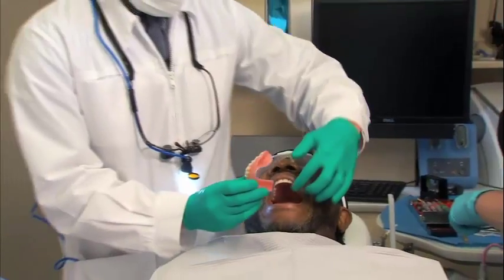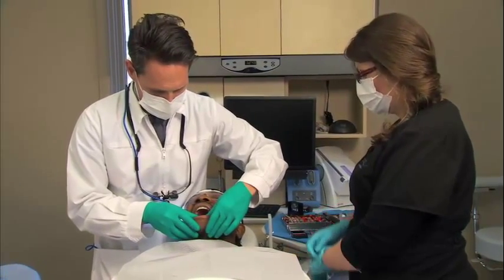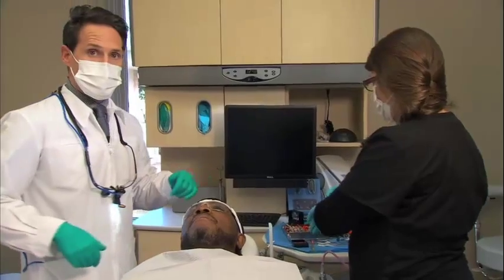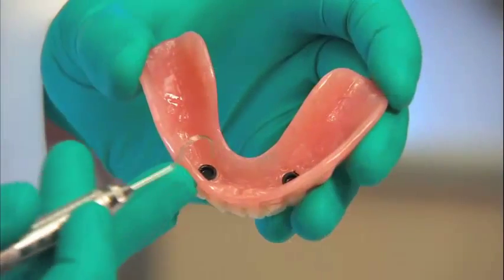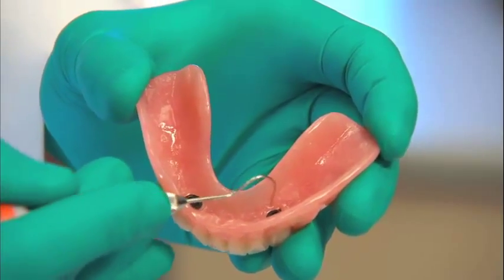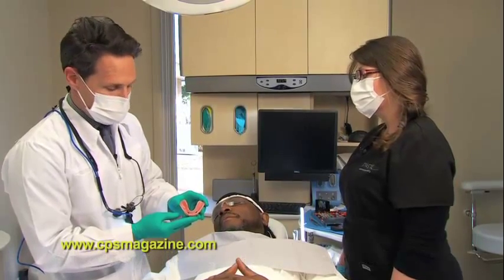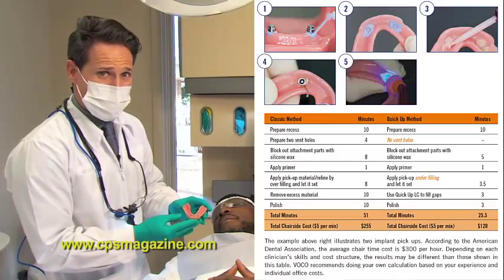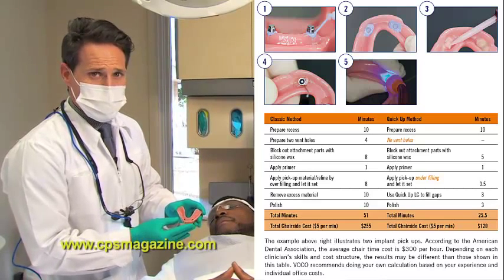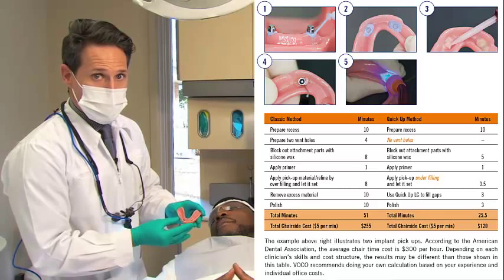I'm going to have Byron open, then seat the denture and have him close with light pressure at about fifty percent. Roberta is going to start the timer for two and a half minutes and we're going to let that sit. This looks great — using the QuickUp self-curing composite material we have very few voids. We still need to replace these black nylon housings with the locator housings. I completed this whole process in about seven or eight minutes, which saves time over competitor products — not having to drill vent holes and being able to do two attachments at once really saved time.